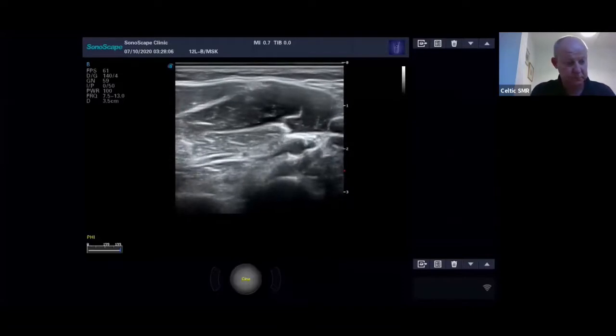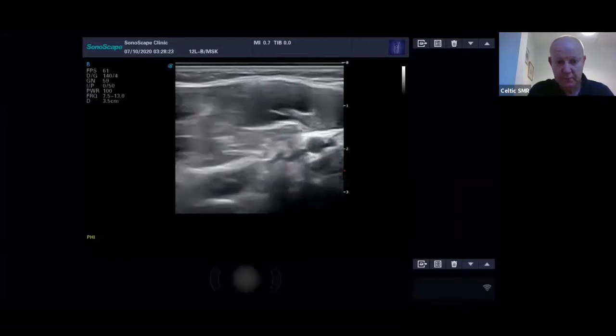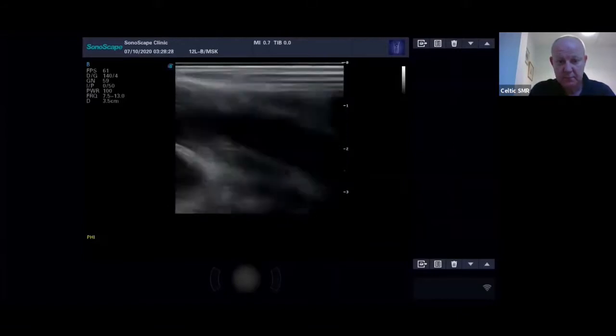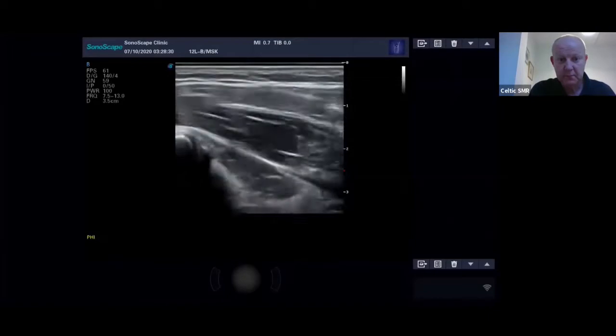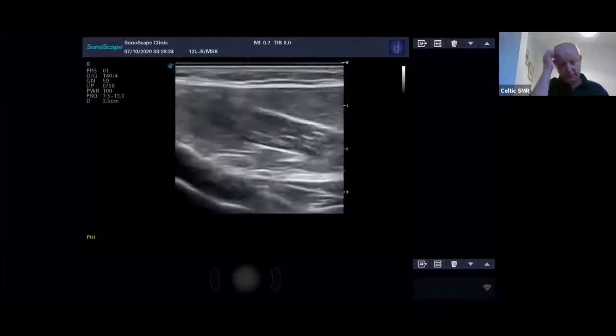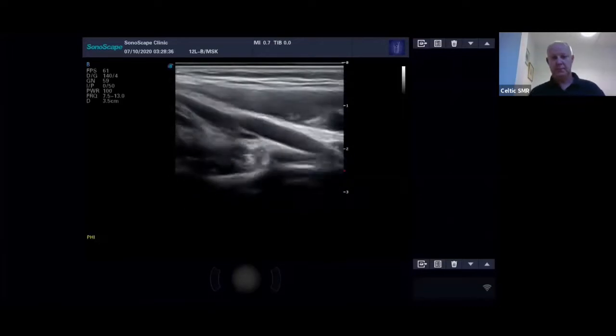So what I've got here is probably one optimised and one isn't. So this one is optimised, where this one looks dark. That's basically where the biceps tendon inserts. Is it always a fiddly tendon to follow? Oh, yeah, it is. Just because it dips down quite deep. And everyone's anatomy is different. And when you come across and you slide it across to find it, sometimes it will just jump out at you.